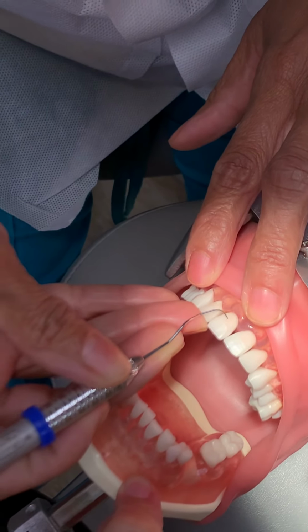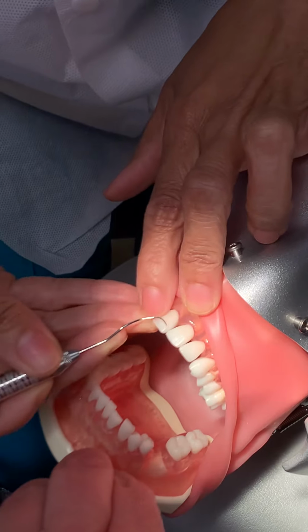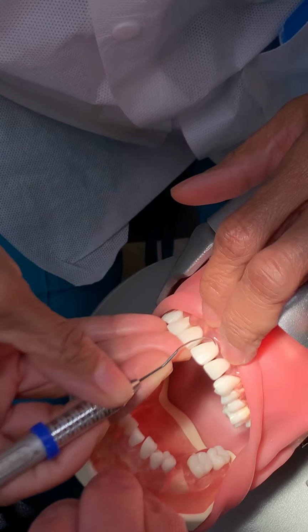Once again, you don't want to get in there and then just slide down like this. You want to work all the way in the proximal, because there's going to be calculus deposit down in there. And you want to make sure you feel. Terminal shank going across. So now I'm on surfaces away.